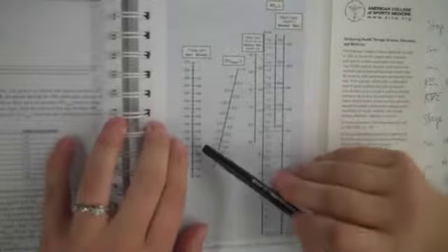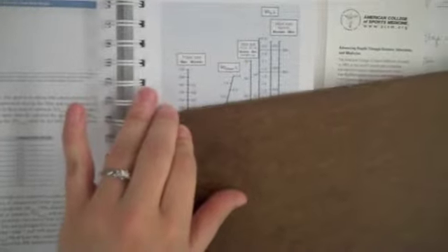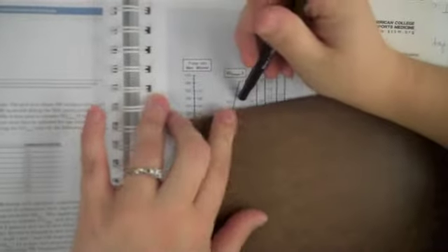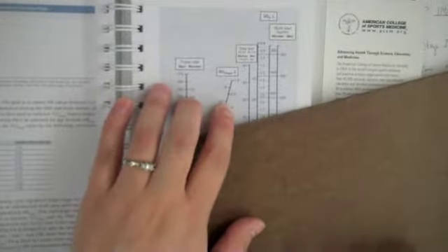Alright, so Ashley's heart rate was at 162, so I'll find 162 on the women's side. Her workloads were at 600. And measure that up. It looks like Ashley would be between 2.2 and 2.4, which will be 2.3 VO2 max.